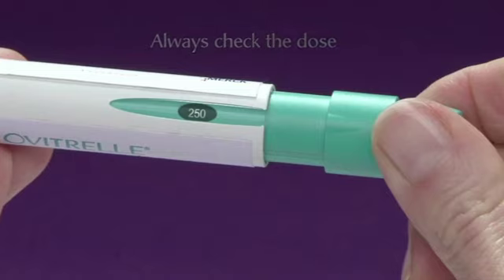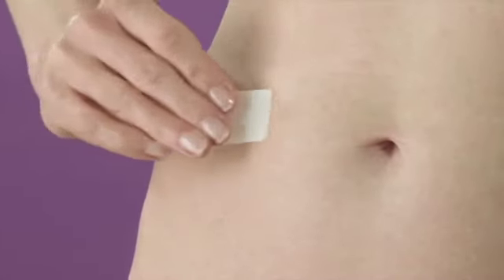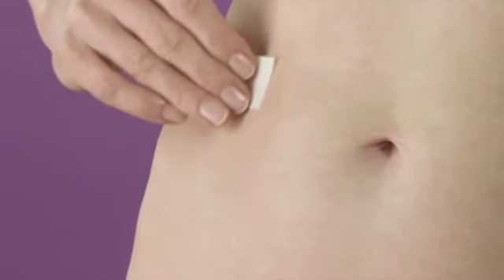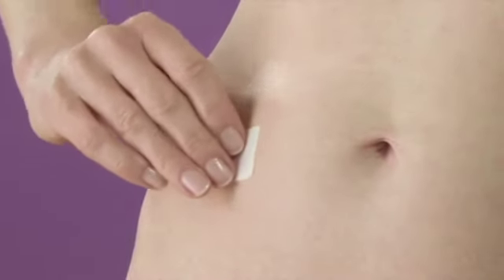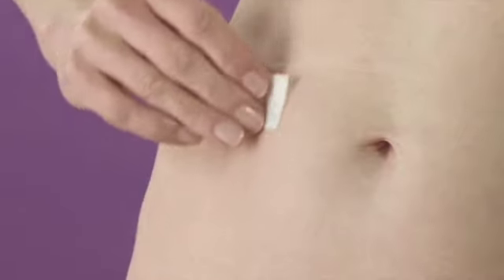Step 3. Inject. Your healthcare provider will have discussed suitable injection sites with you. To minimise discomfort, it is best to select a different injection site each day. Clean the recommended injection site with an alcohol swab and let it air dry.